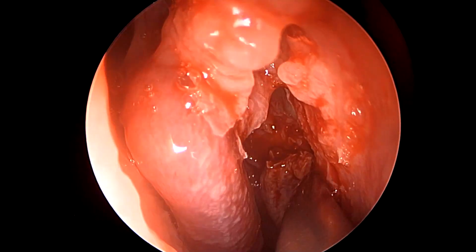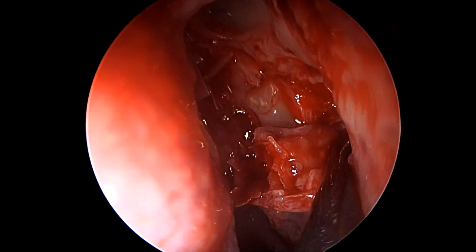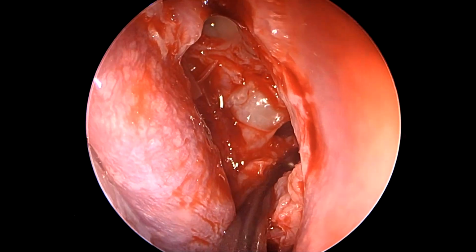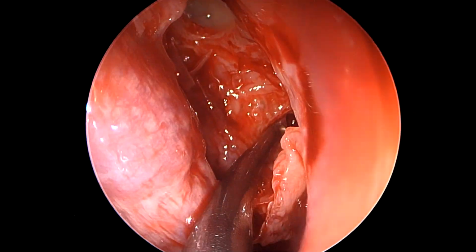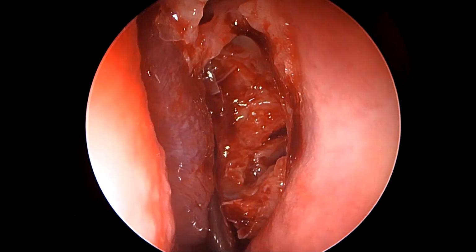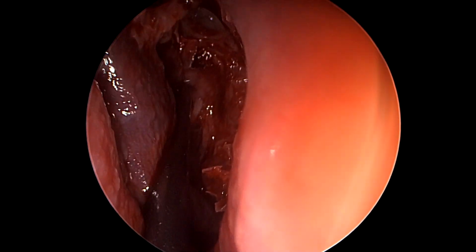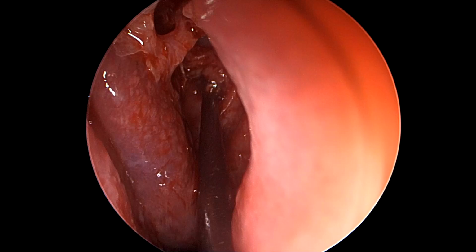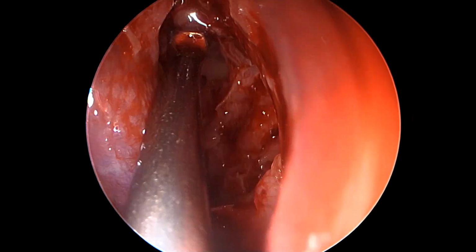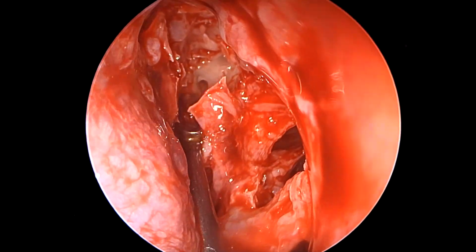Here we come on the left side. On the left side, we repeat the same procedure. We initiate the process with the maxillary antrostomy and uncinectomy. And of course, it is mandatory to remove the most superior part of the uncinate process if the goal of surgery is to indeed open the frontal sinuses. One can use a curved suction, one can use a frontal sinus curette, sometimes a ball probe. All these instruments are good. Here we go behind the bulla ethmoidalis and again back fracture it. Once you are back fracturing, you know approximately your level of base of skull, and the possibility of pushing an instrument inside is very less.